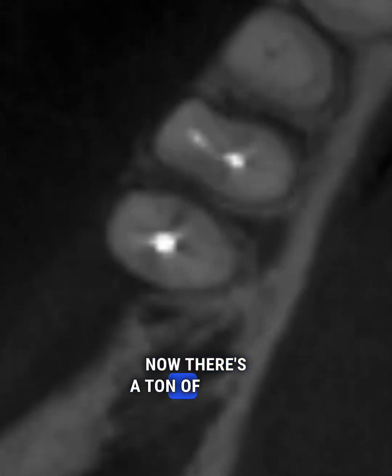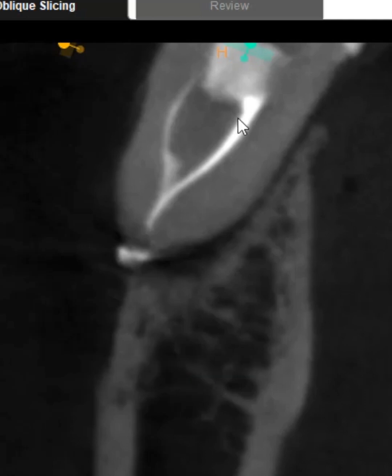Now, there's a ton of sealer out the end. That's a whole other video, but I wanted to share with you humbleness, astonishment, and grace at what we're able to accomplish. You can see that retro, clean, and fill.